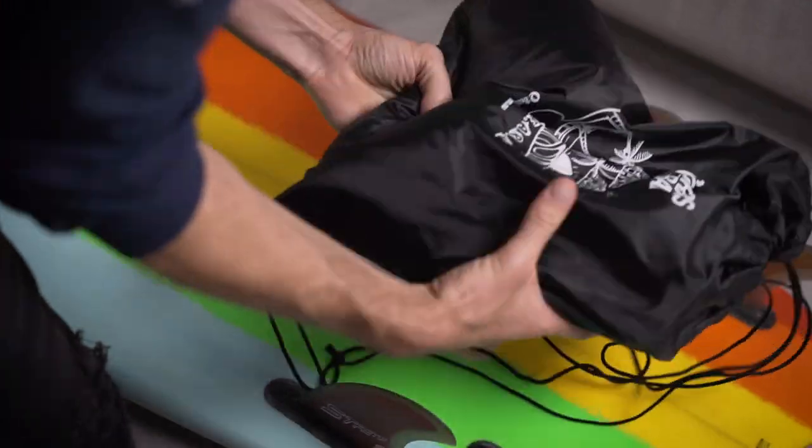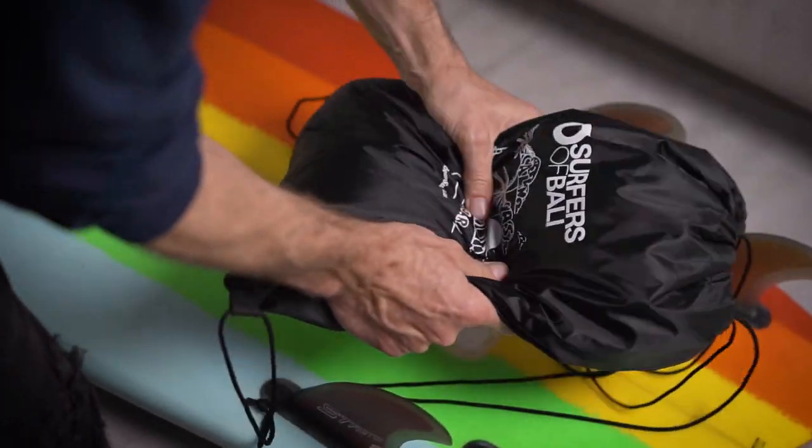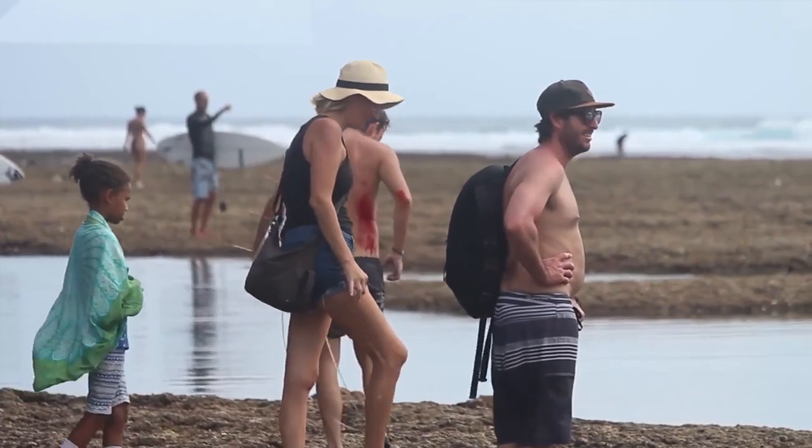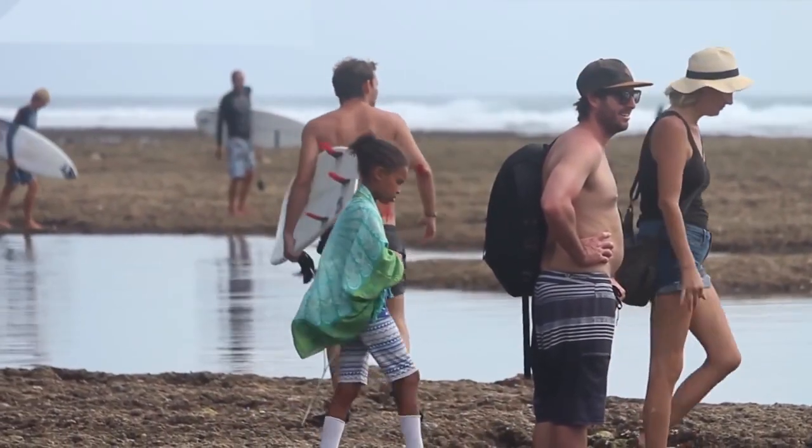This kit's designed to fit snugly in your board bag without any hard parts that are going to dent your quiver, and also cover you for most of the common annoying things like digging out urchin spines, dealing with sunburn, to some more heavy stuff like patching up holes when you've had run-ins with somebody's fins or nose, or even picking out coral if you have a run-in with the reef.